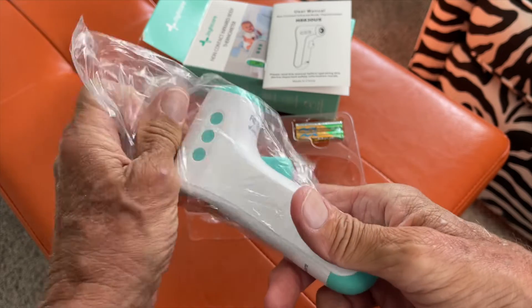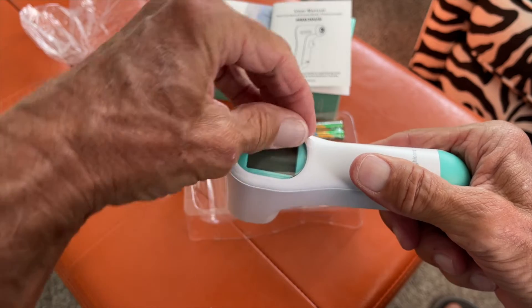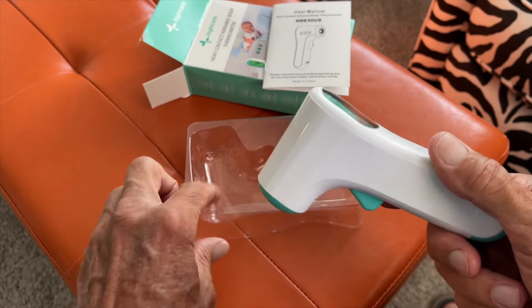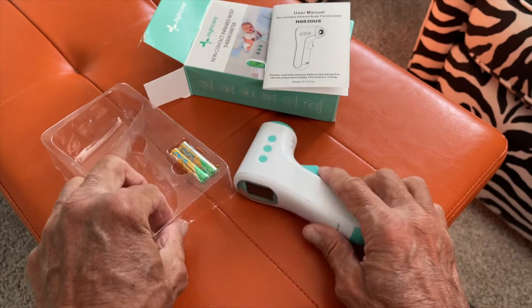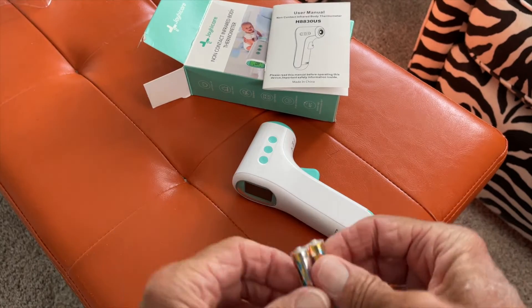But that's okay — we can use two, right? It's got a little plastic thing you've got to pull off. Let's go ahead and get the batteries, before we can use it. We'll slide all that over there.